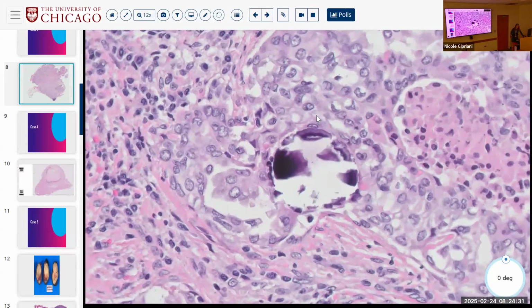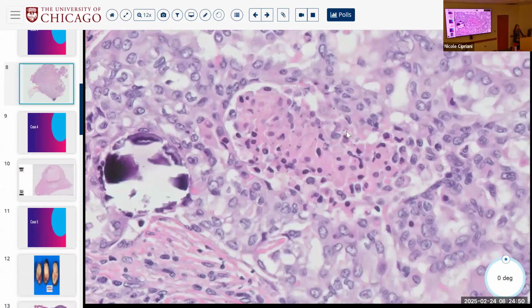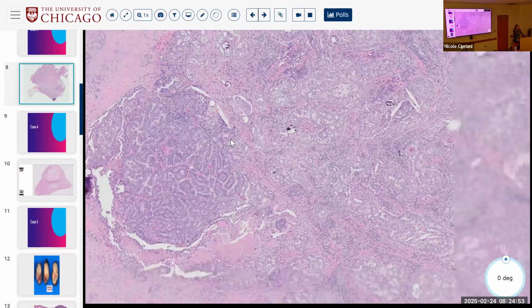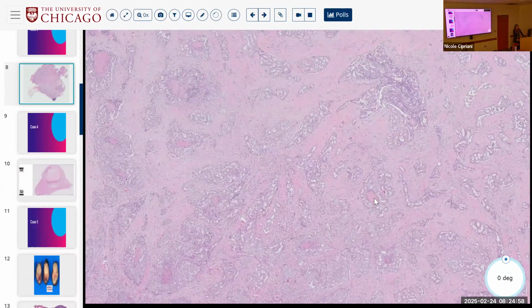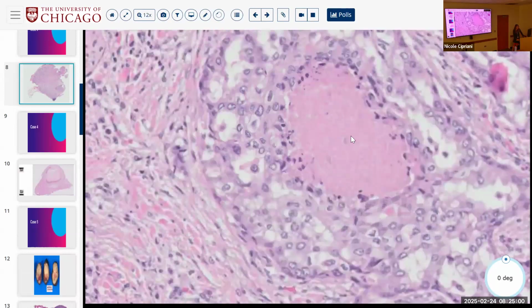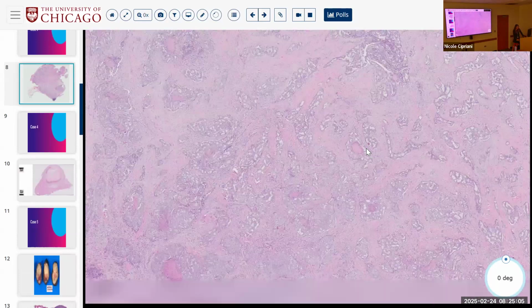If you don't decalcify these, which is fine, you don't have to decalcify them, but when they get cut in the microtome, they chunk out. But often you'll still see the little concentric lamellated bits right at the edge. So this would be a concentrically lamellated psammomatous ring. And everywhere you see these little punctate foci of necrosis. So when you start seeing these very brightly eosinophilic things on low power, go check them out because chances are they could be necrosis. So you have a high-grade papillary carcinoma, check.